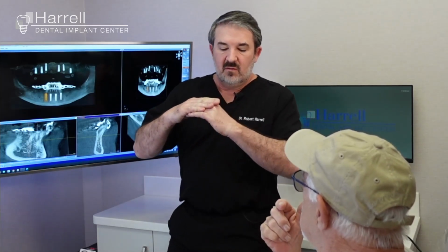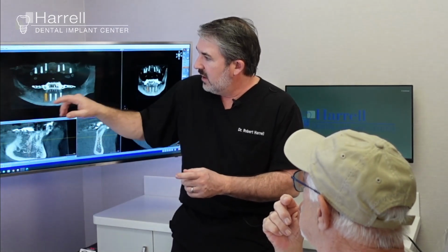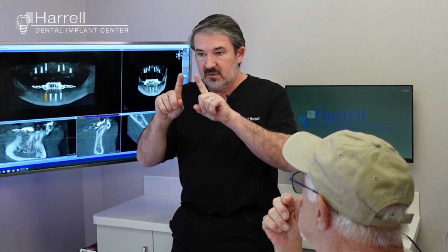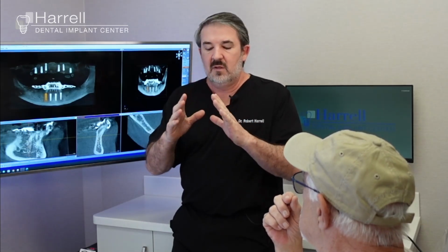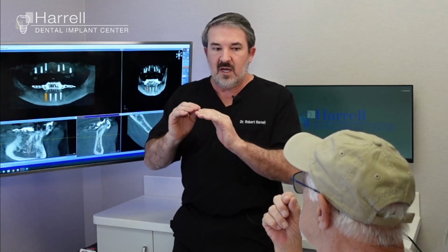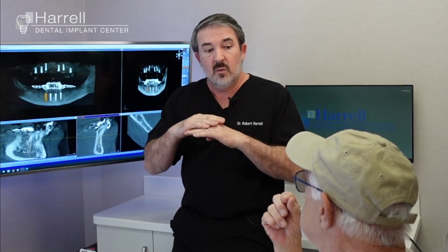So they never, I guess what's the word? They never attach to your gum. They are resting on the gum. So the implant itself is sitting down in the bone, like we see here. And then on top of the implant is an abutment. The abutments look like a little teepee or a little pyramid. It's just a circular conical form, so that screws into the implant on one side and into the teeth on the other side. So it's an interface between the implant and the teeth, but then the teeth are built to just rest on the gum with a little bit of pressure.